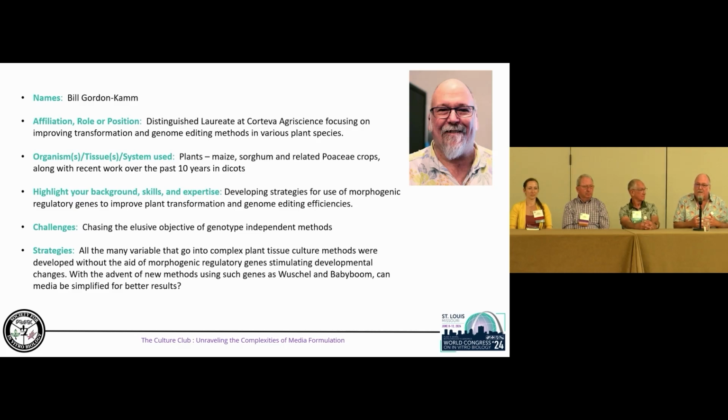And so one of the areas that I'm interested in now is we have genes like Wuschel and Baby Boom and others that will stimulate somatic embryo formation or different combinations that will stimulate shoot formation. If we use these new genes now as the crux of our system, what can we remove from our media to simplify the media and maybe even start from scratch and rebuild it? So listening to the presentations this morning on how to build a media from scratch was kind of exciting, but also kind of scary.